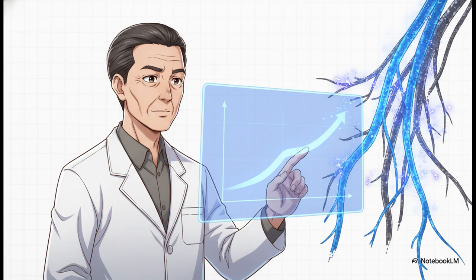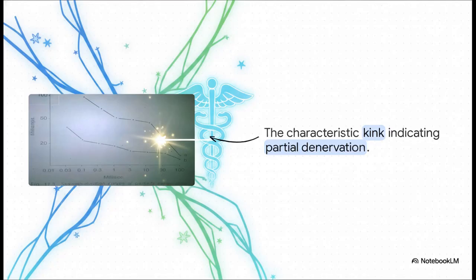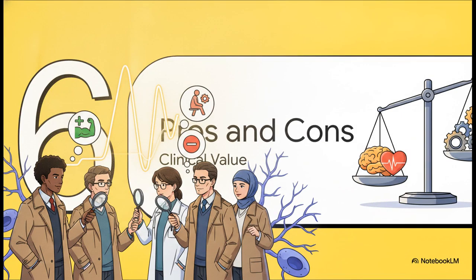kick to wake up. So the absolute crucial point is right where these two different sections of the curve actually meet. It forms this highly characteristic kink. And guys, this kink is literally the visual proof we asked about at the very beginning of the explainer. It shows the exact intersection between the healthy nerve responses and the damaged muscle responses. When a doctor sees this kink suddenly appear on a previously steep denervated curve, they know for a fact that reinnervation and healing are actually happening. It's amazing.